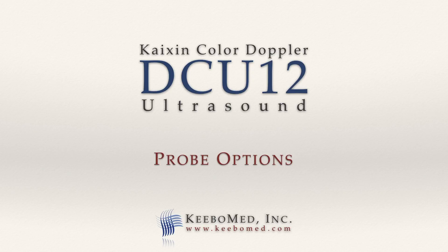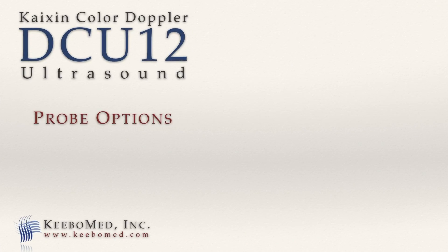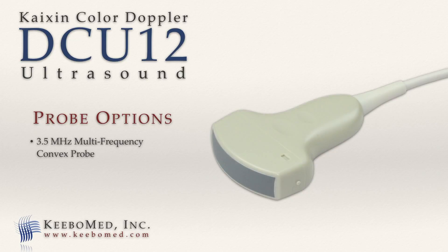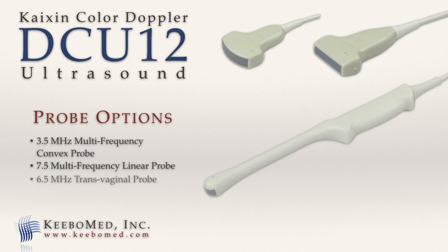The DCU-12 supports three different probes: a 3.5 MHz multi-frequency convex probe, a 7.5 MHz multi-frequency linear probe, and a 6.5 MHz transvaginal probe.